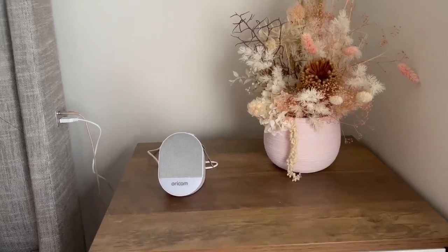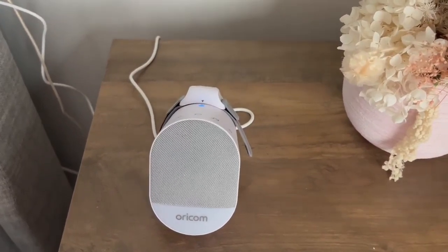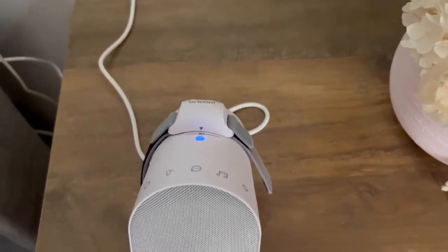I have the base unit next to my bed because my baby is still in the bassinet in my room. That's the wearable charging.